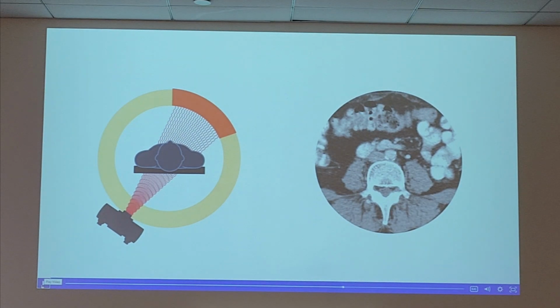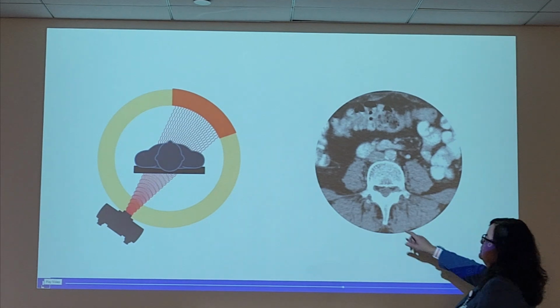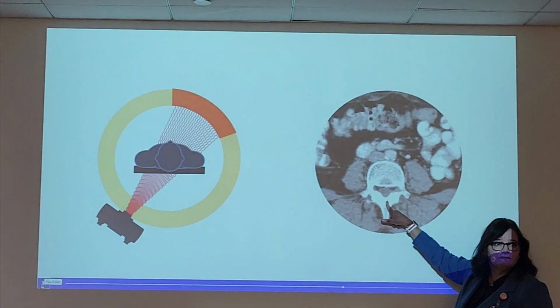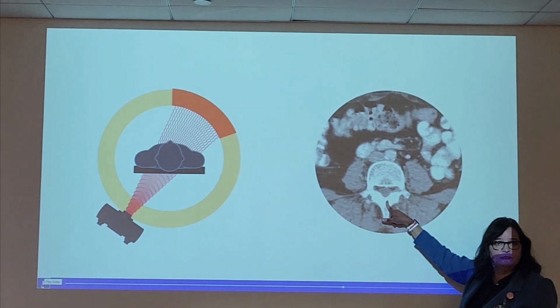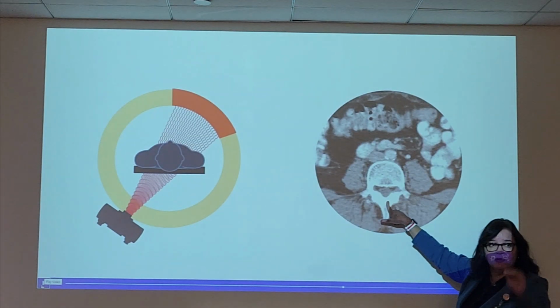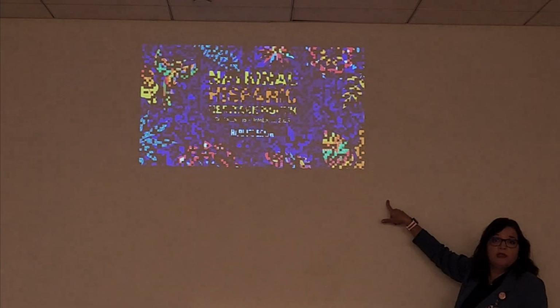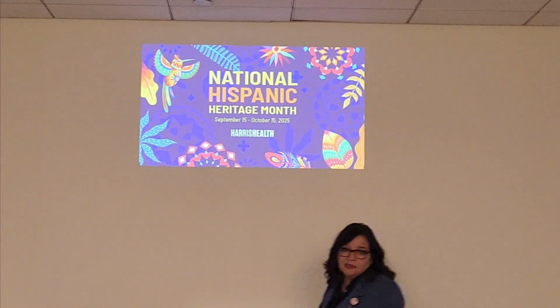Why do we lower our KVP for extremity work? Do we want x-ray to absorb and just outline the bones? That's why we go less on KVP. We want less punch through on compact bone. We lower the KVP because we want to outline the bone. We want it to absorb so that we can see the bone.